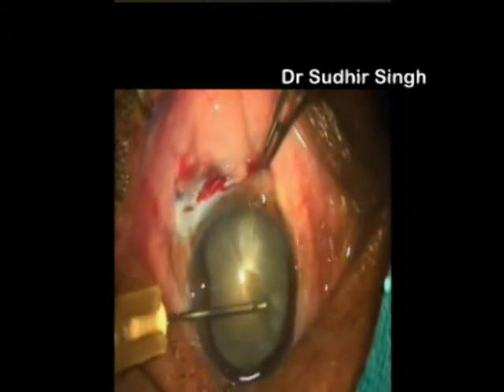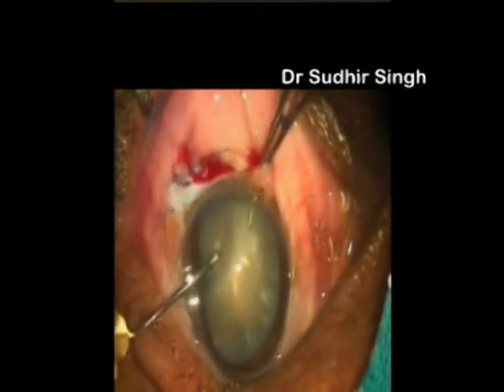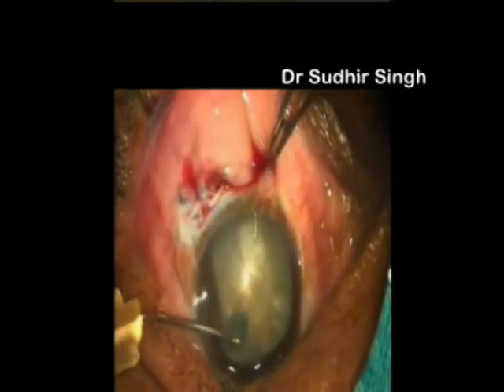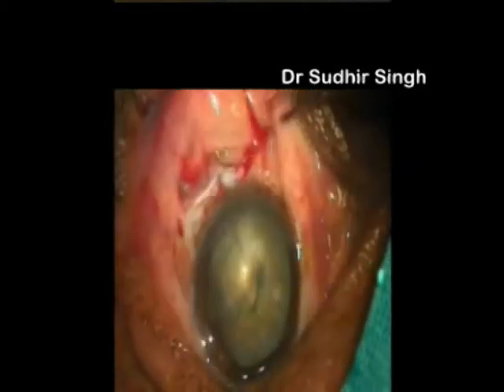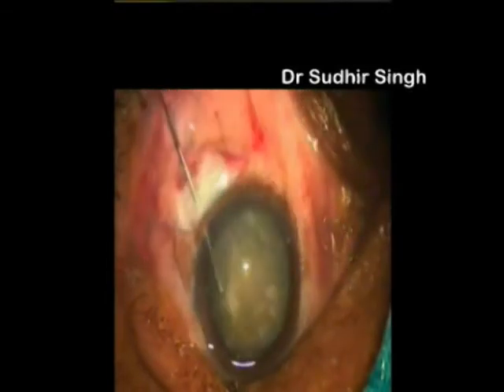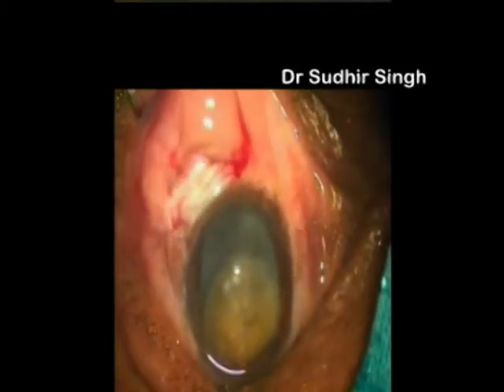We are going to demonstrate 5.5 mm intratunnel phacofracture in rock-hard nuclear cataracts. Capsular hexis is done. Tunnel is enlarged to 5.5 mm. Hydrodissection is done. The nucleus is prolapsed into the anterior chamber with the Sensky's hook.